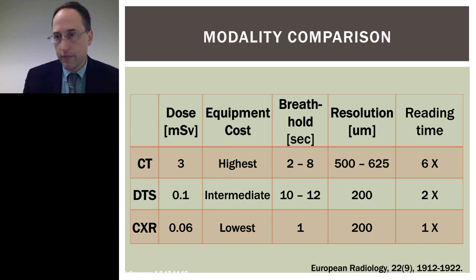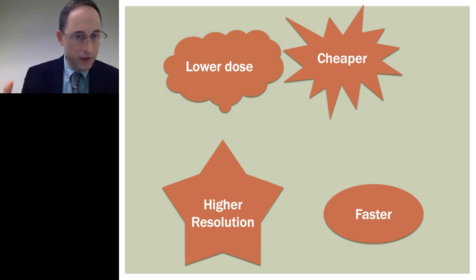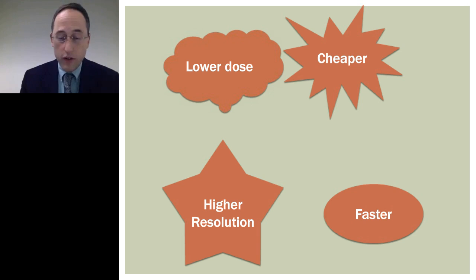Okay, so tomosynthesis sounds great. I mean, it does sound great. I actually think it is wonderful. I'm not saying it's the answer to everything. Absolutely not. I'm just saying it has unique advantages, and that those can be leveraged in certain clinical scenarios where you might be able to find answers or deliver care that you wouldn't be able to with other modalities.